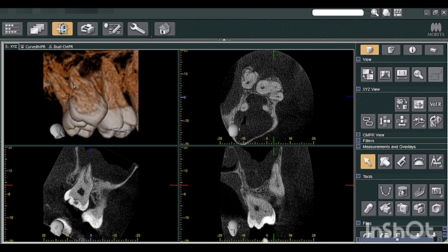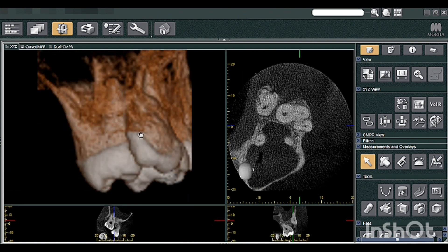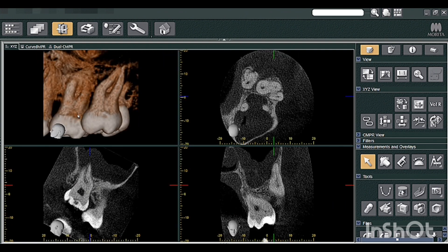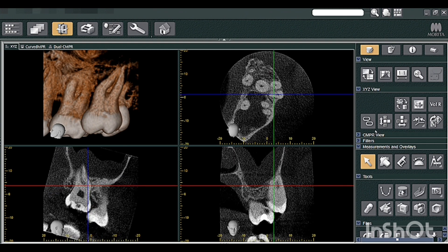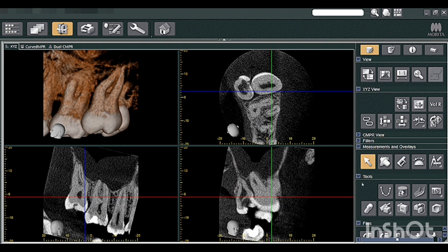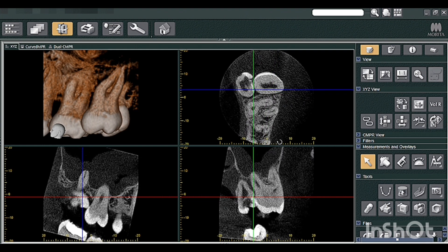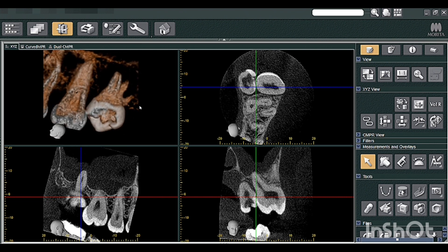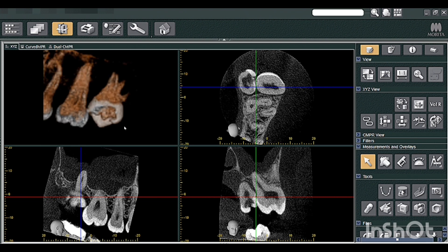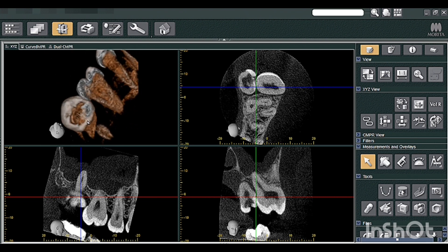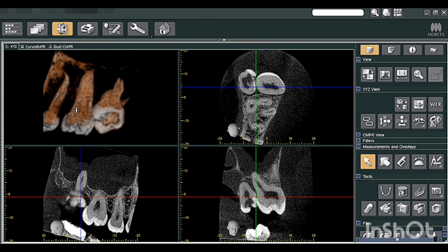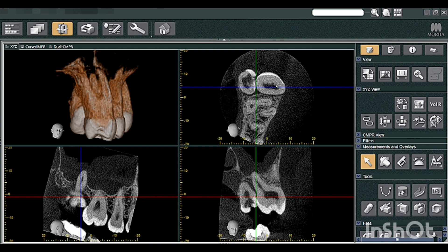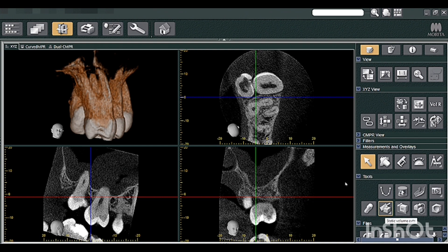Coming back to the study of impacted tooth 28 — this is the palatally placed 28. If you want to study 28 and get rid of the other structures, you can use the cutting tool. Go to your tools, get the green line in between 27 and 28, and use the cutting tool. Now you can easily check out the grossly decayed tooth structure of 28 — this is your 28 which is grossly decayed. This will help the dentist for proper planning. Similarly, you can get the blue line above between 26 and 27 and make a cut for the frontal view.